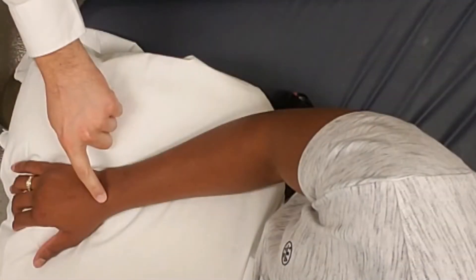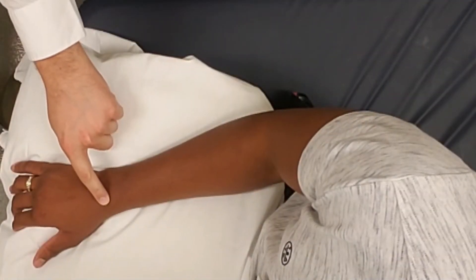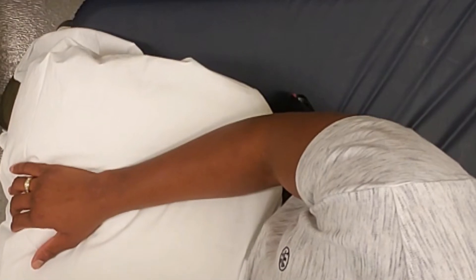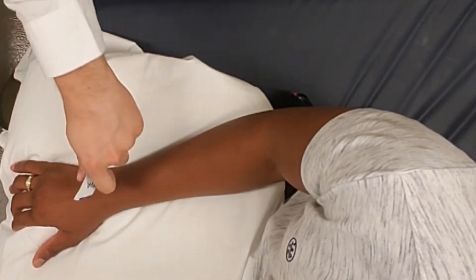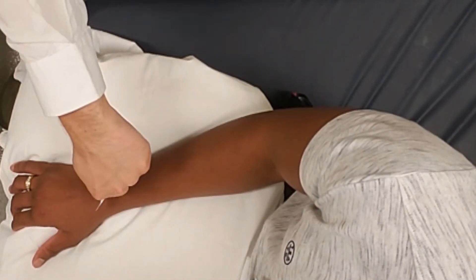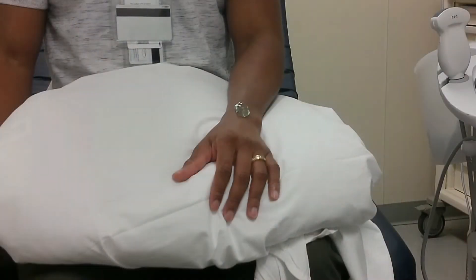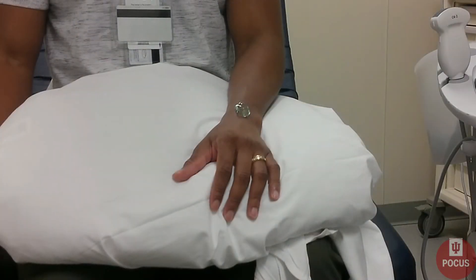First, we'll start at Lister's tubercle, which can easily be palpated on the dorsal side of the wrist, and we'll put our gel on Lister's tubercle, which will be our home base for looking at the dorsal side of the wrist.